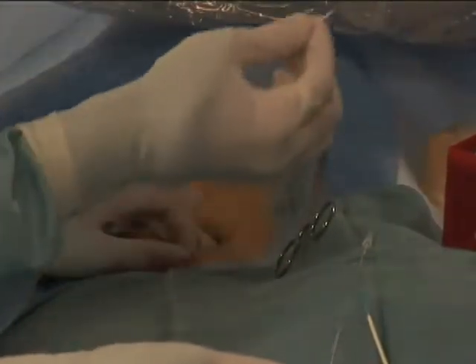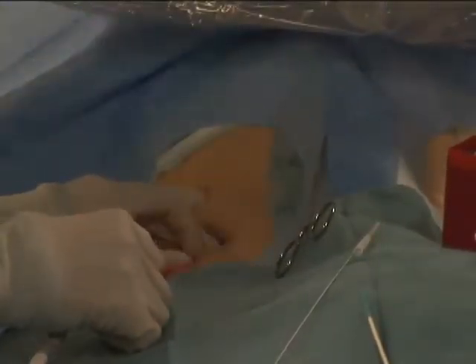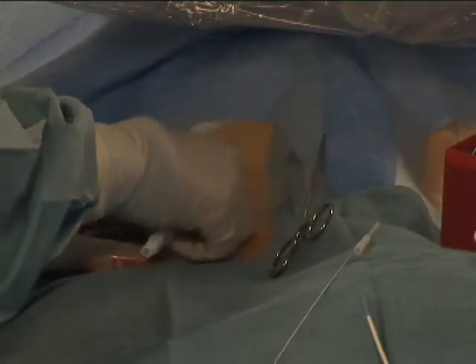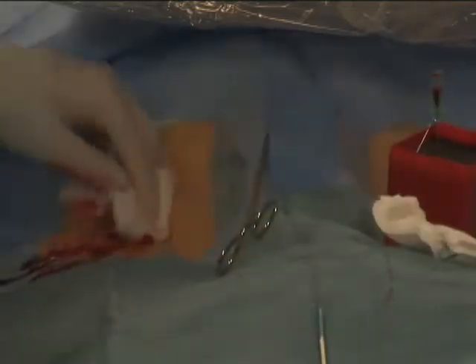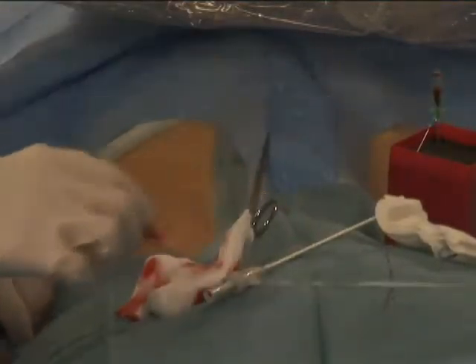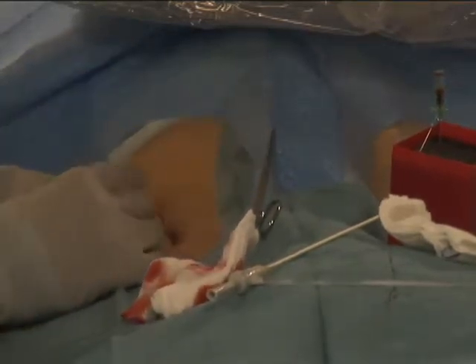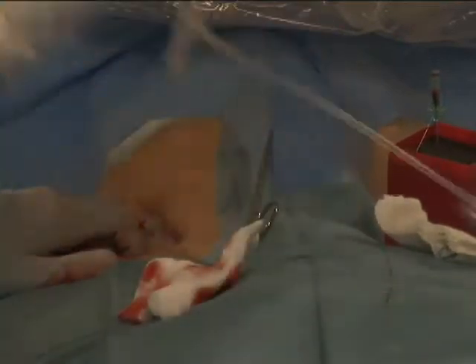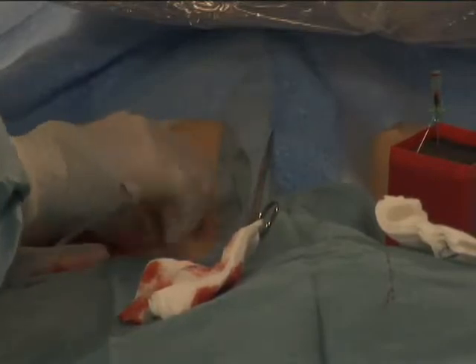The micropuncture needle is removed over the wire and a microcatheter is advanced through the skin and into the vessel. The dilator and microwire are removed and a standard J-tipped wire is advanced through the microcatheter into the descending aorta. The microcatheter is removed over the J-tipped wire and the standard vascular sheath, either 4, 5, or 6 French in size, is advanced. The sheath dilator and J-tipped wire are removed, and the sheath is flushed with heparinized saline.